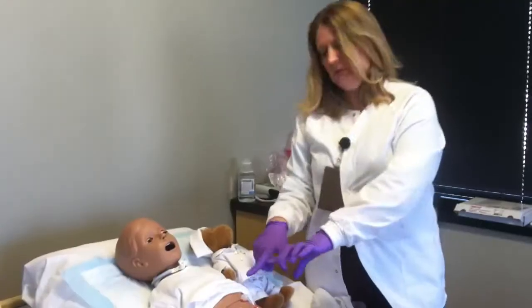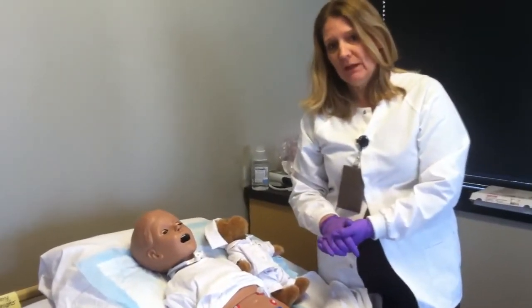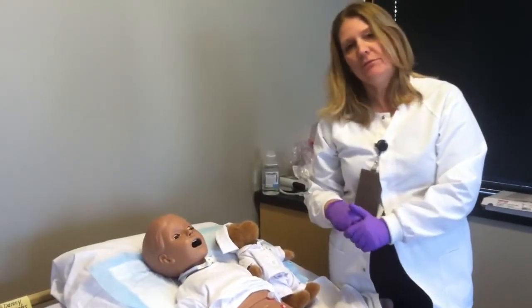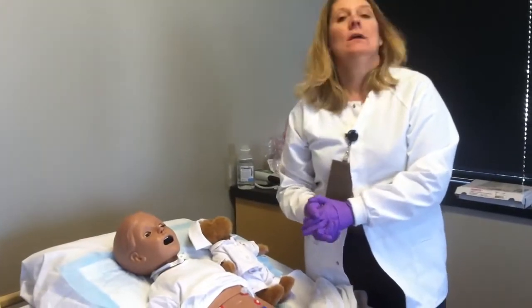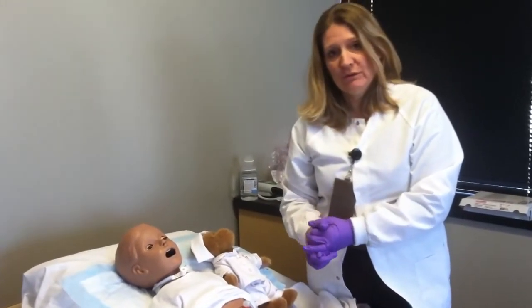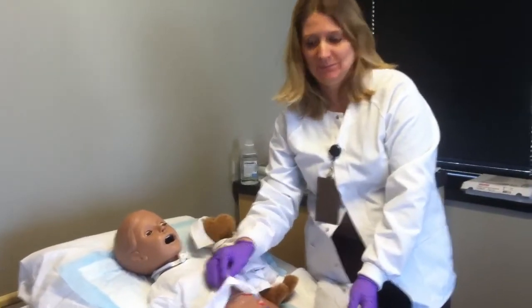Some G-tubes have dressings, and those would be an ordered thing. A lot of the new Mickeys, they don't have dressings at all. In fact, dressings can hinder some of the healing, but you'd have to check with your orders. This little guy doesn't need one, so we would not put a dressing on him.